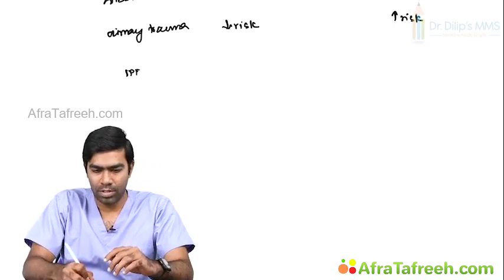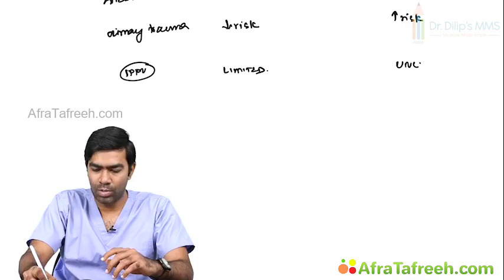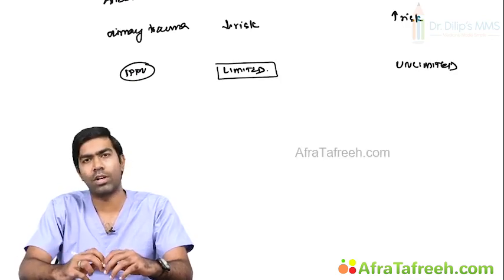And intermittent positive pressure ventilation, IPPV. Remember, it is limited with supraglottic airway devices, but with the endotracheal tube it is unlimited. How much ever you want, you can give. Theoretically, at least, it's limited with supraglottic airway devices, which means you cannot give so much intermittent positive airway pressure, because there will be some back leak or leakage into the esophagus at extreme pressures.